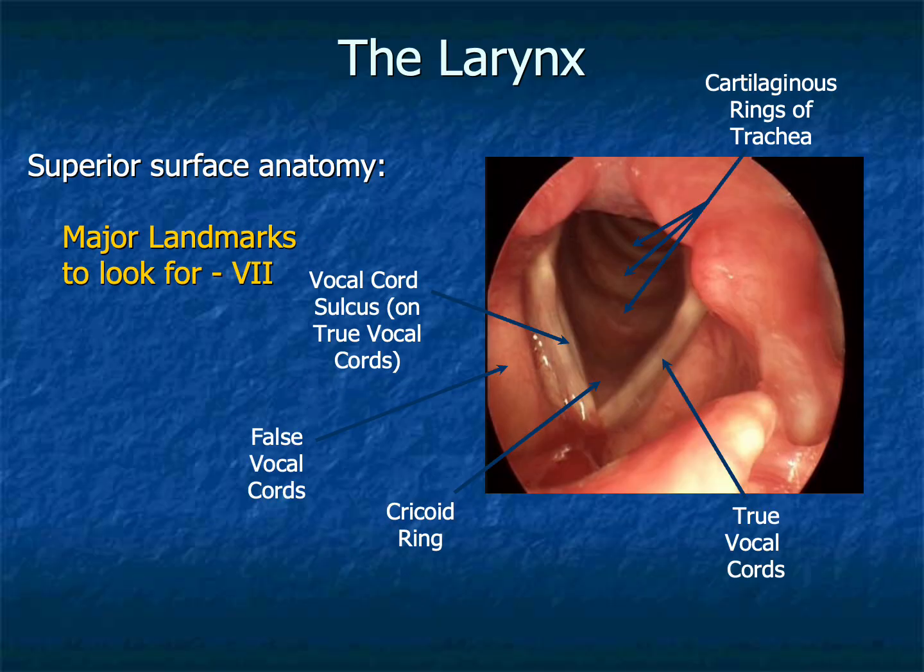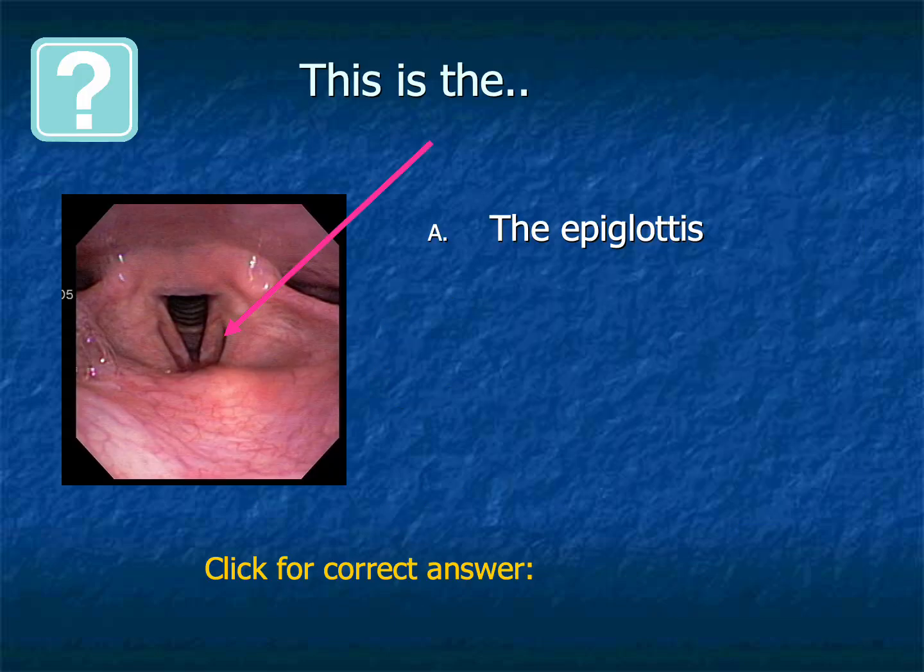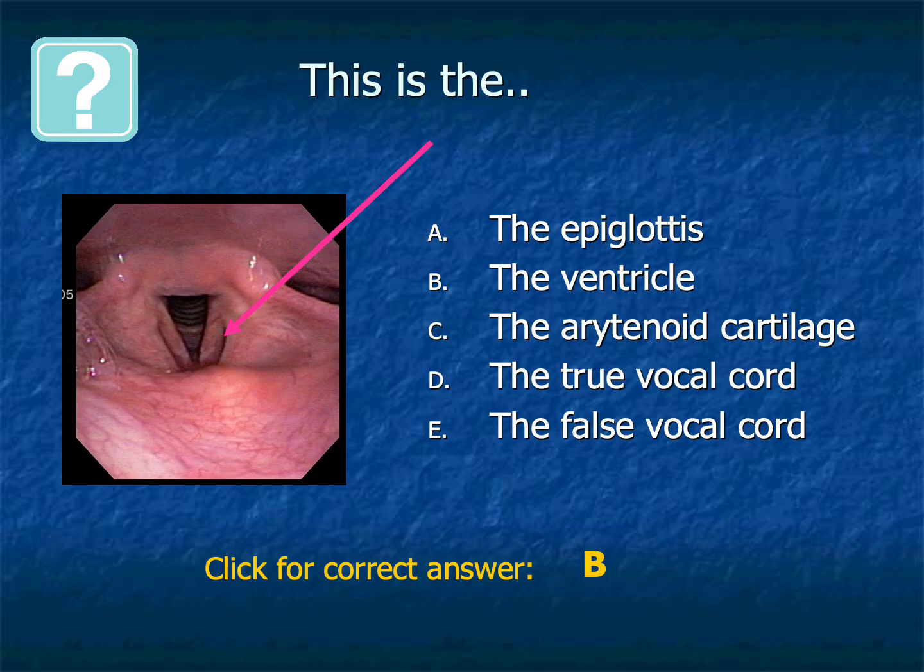This teaching slide emphasizes an important educational principle. Anatomical learning requires active observation rather than passive viewing. Each element of the airway must be studied deliberately. I always believe that the airway must prove itself to be normal. I enter the airway with my bronchoscope, thinking there's an abnormality to be found.